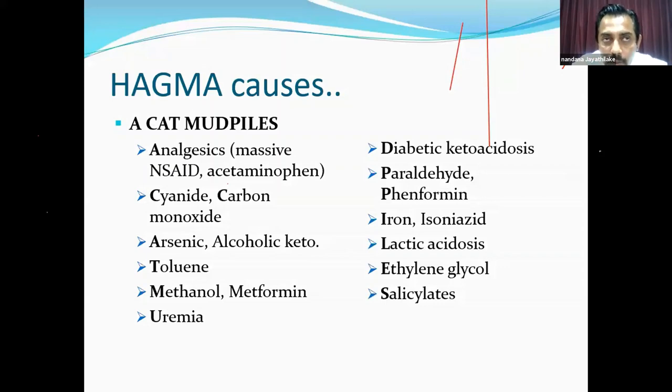So if you have a patient with a high anion gap, you identify the primary metabolic problem and sort it out. Then at step 3, you find that the patient has high anion gap metabolic acidosis. Now you have to find the cause for this. We can get to the diagnosis, or close to it, with the blood gas or a differential diagnosis.